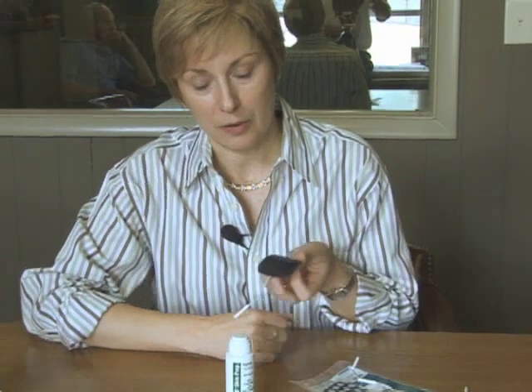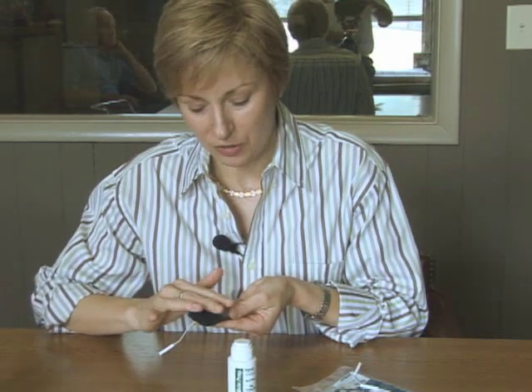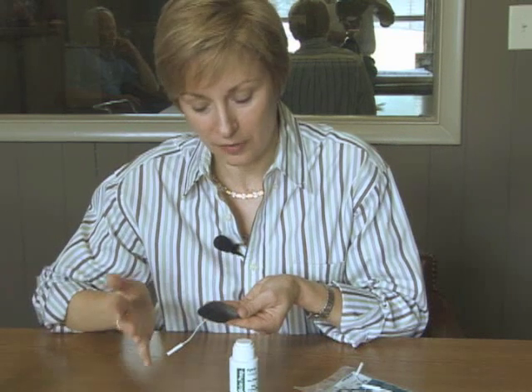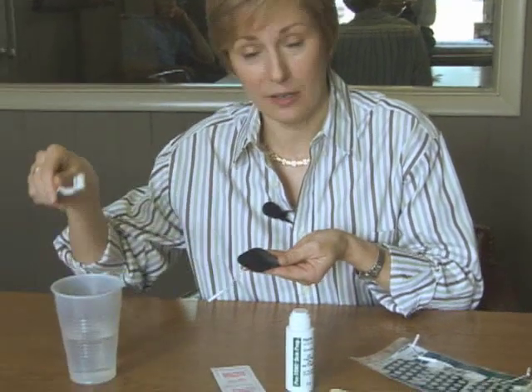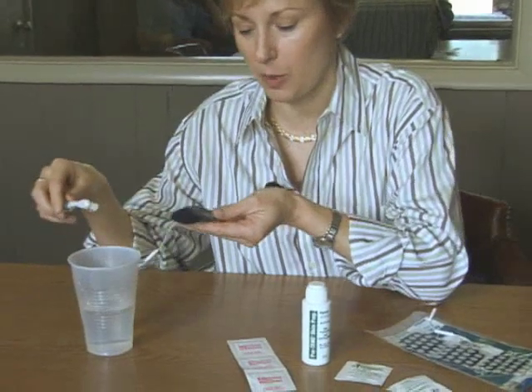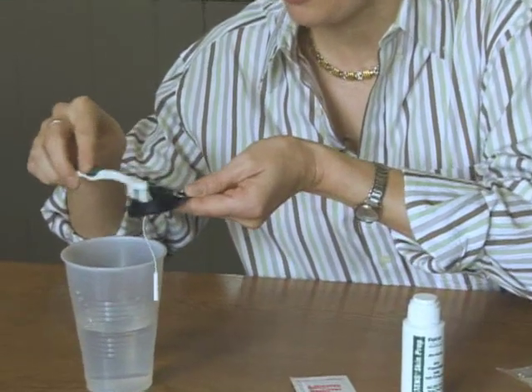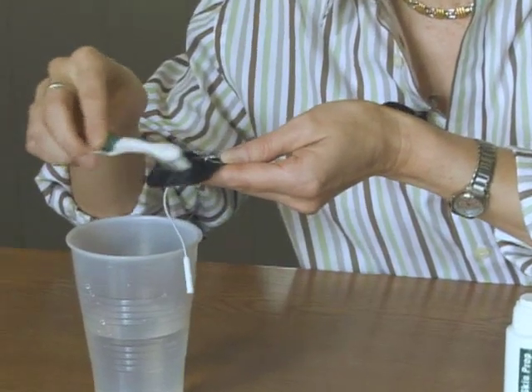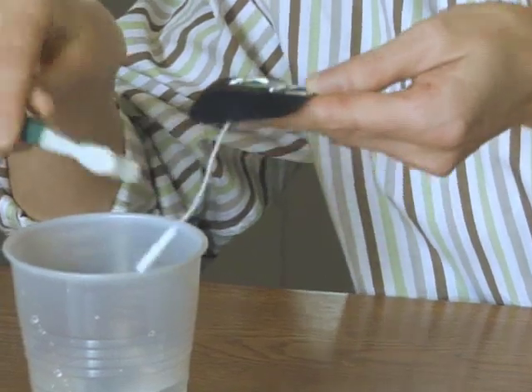Now, in caring for your electrodes, after you have removed this from your skin, it's actually pulling up little tiny skin cells, which are going to adhere onto the sticky surface of the electrode. And to remove those and make your electrode actually last longer, you can use a little bit of water and an old toothbrush that you save for this purpose, and simply wet it slightly and just brush that off and get some of that stuck on skin cells off of there.